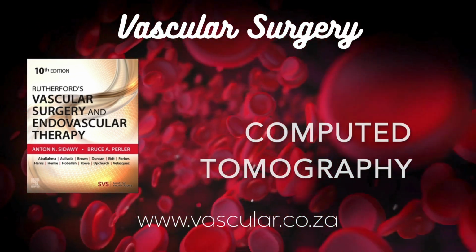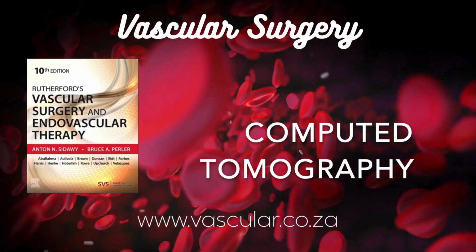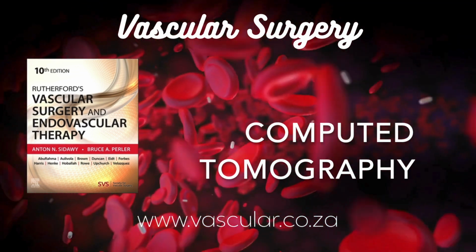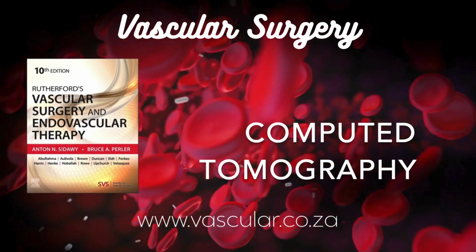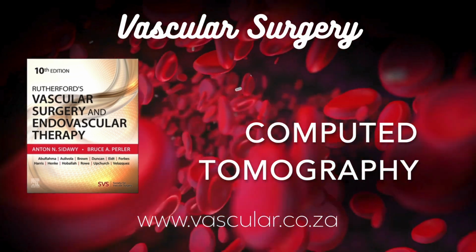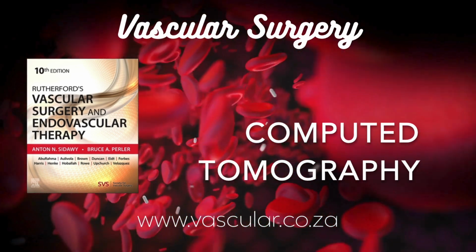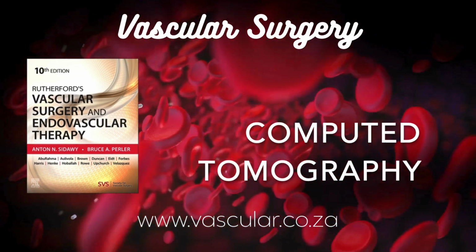Lastly, what about vascular malformations? Those complex tangles of vessels. CT's role there is pretty limited. It might help characterize high-flow lesions like AVMs, arteriovenous malformations, or AVFs, arteriovenous fistulas, but it's not great for seeing the really fine details of the nidus, the core tangle of vessels, and it's not very helpful for low-flow malformations because CT doesn't show soft tissue differences as well as MRI. So ultrasound and MRI are better for malformations. Generally, yes. They're the go-to modalities for most vascular malformations.